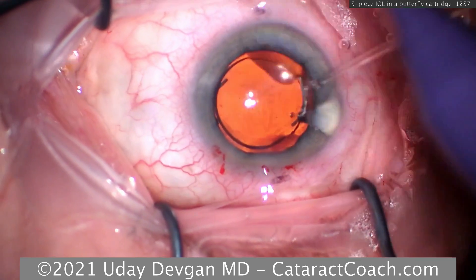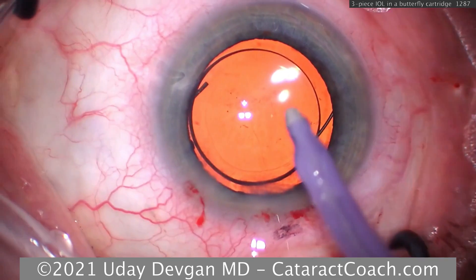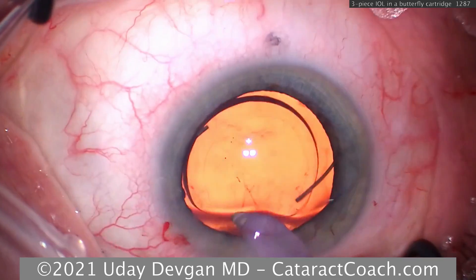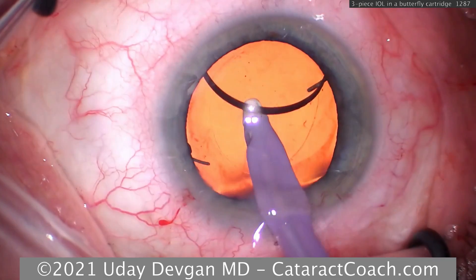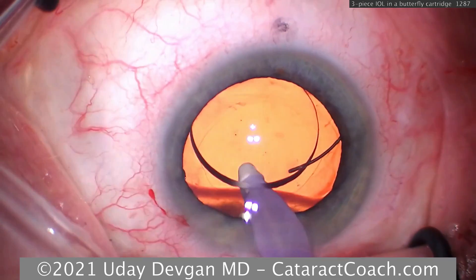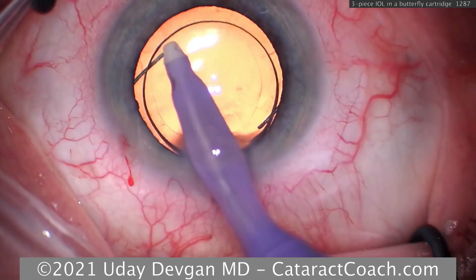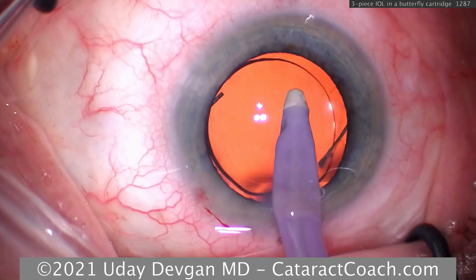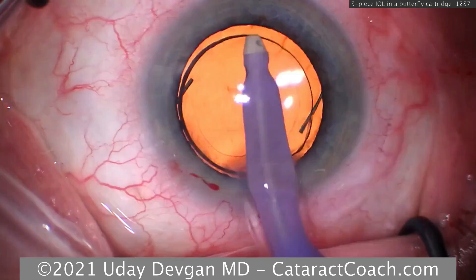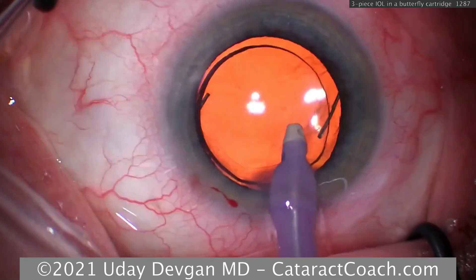These three-piece lenses are planar to a degree, but they have an angulation at the haptic-optic junction — five or ten degrees. So while the optic may be planar, the haptic-optic junction has a tilt. By putting the lens in upside down you are doing yourself a disservice: the lens will not sit in the capsule bag where you think it is. You'll change the effective lens position — maybe not a huge deal when lens power is near zero, but you still want the lens in the correct orientation.